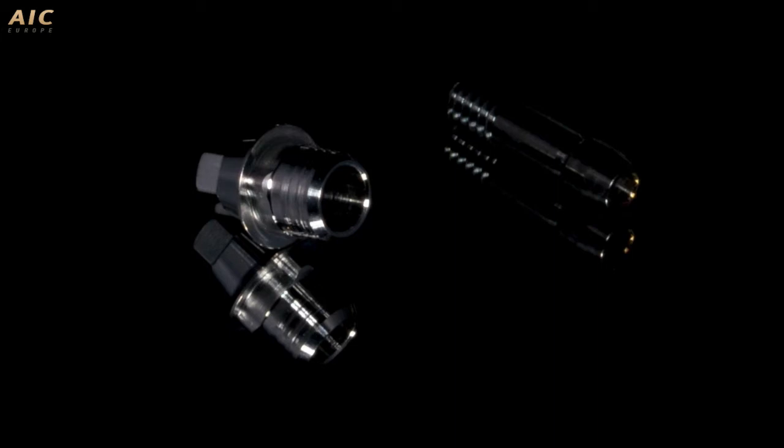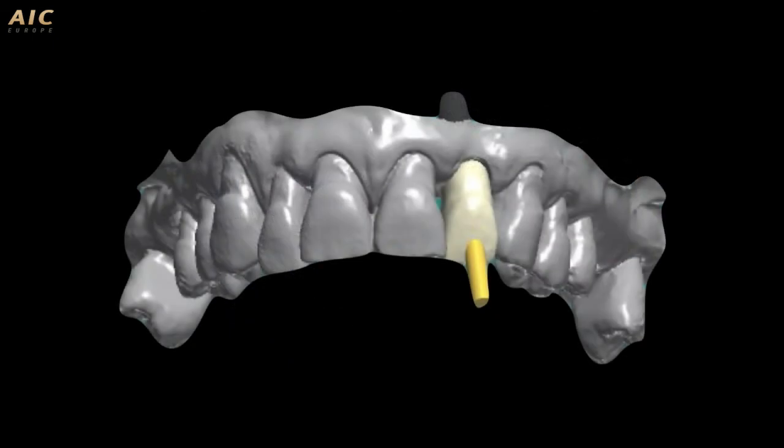To realize the crown this way, we can use the TS link abutment by Osstem. The TS link abutment comes in two lengths, 3 millimeters and 5 millimeters. In this case I can choose the 3 millimeters because I need a low crown. But we have a big problem, because this is the emergence profile of the screw of this crown.